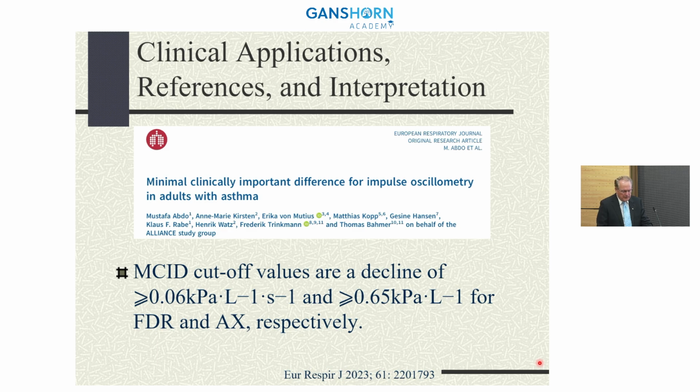And in this paper that was published also in 2023, and you can see that a lot of this information is relatively new, because even though oscillometry has been around since the 50s, it's really only in the last decade where we've seen an increase in its use. And part of that is the portability of the units and the reduction in the pricing of the units so that it's available to more individuals.